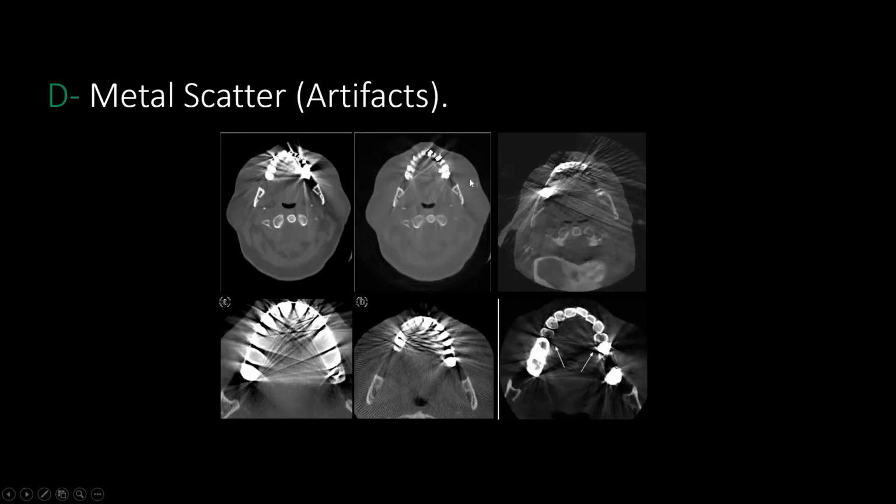So this is how metal scatter usually looks. All of us are pretty much familiar with this. And again, we'll talk about this in more detail today.